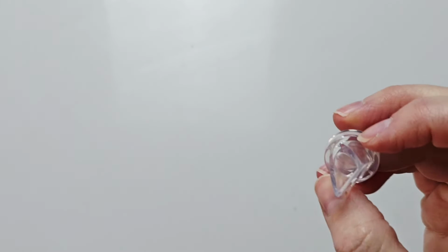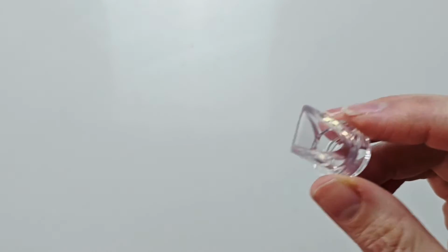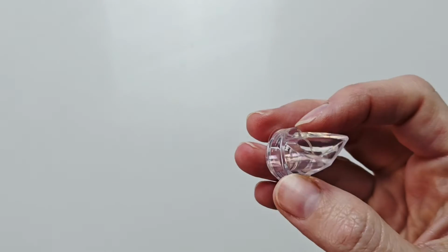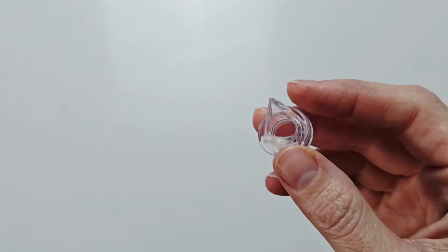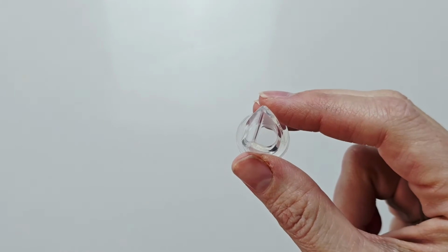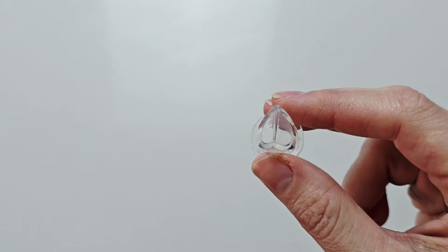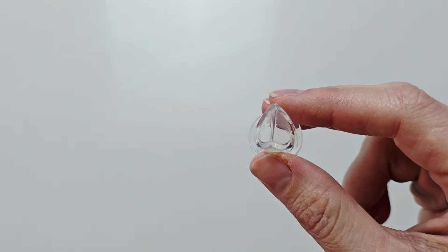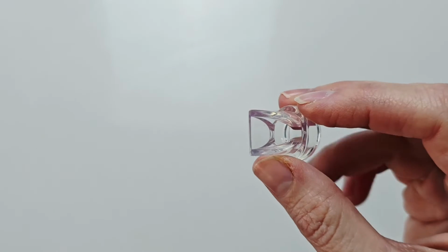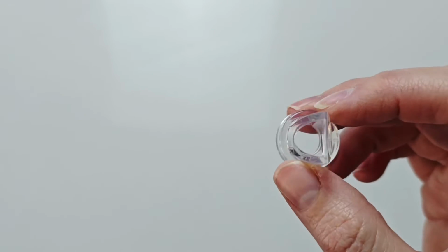And firstly, you have your duckbill valve. Now, depending on your pump usage, these need to be changed out every 1 to 3 months. These are integral for maintaining your suction. So if you find during a pumping session you're not getting as much suction or output, I highly recommend you start by swapping out your duckbill valve.